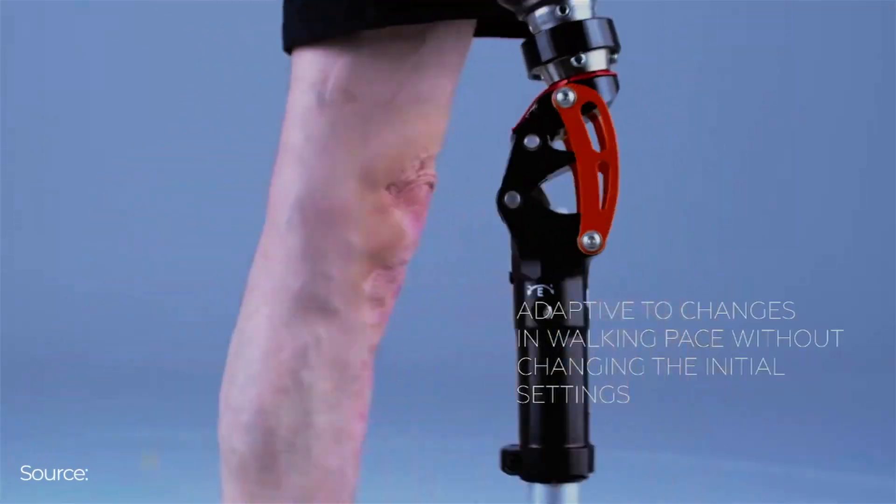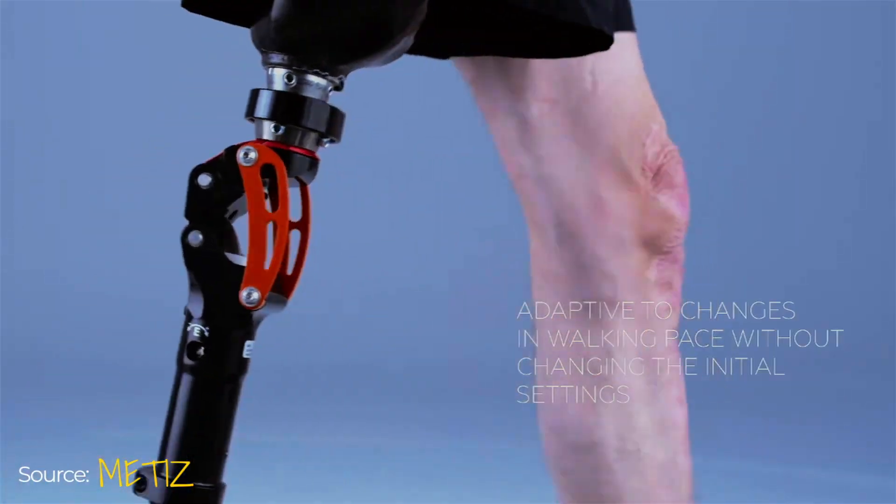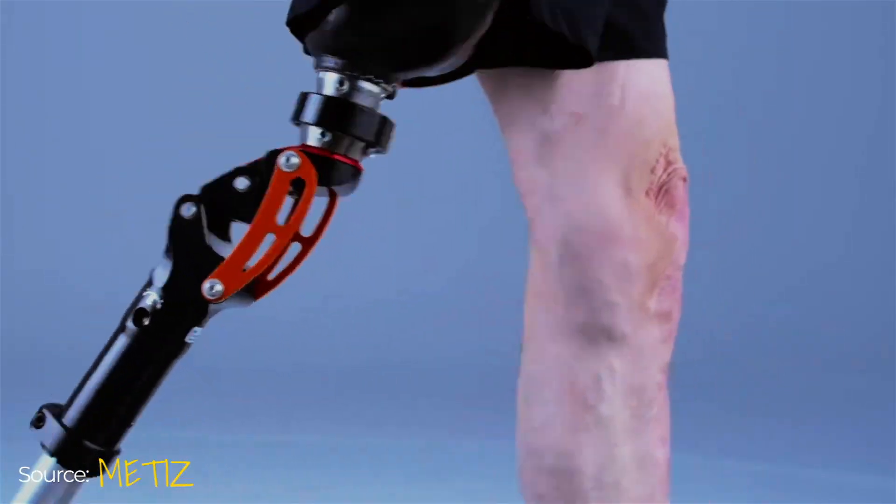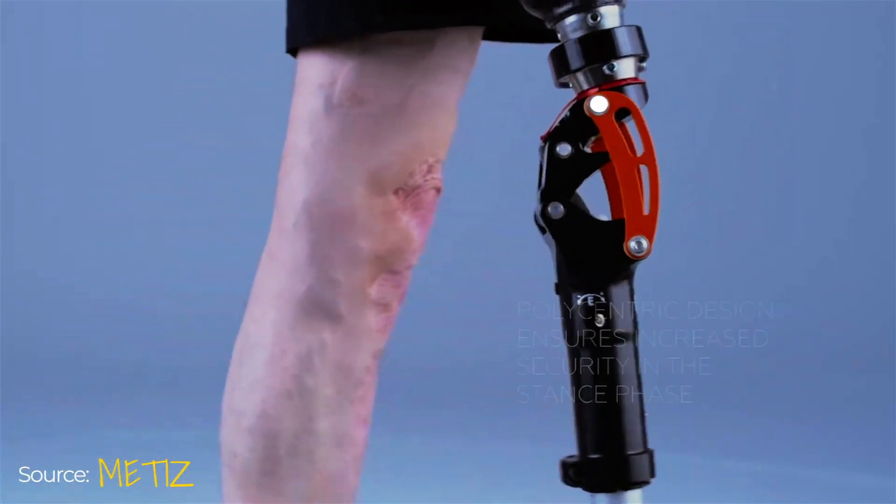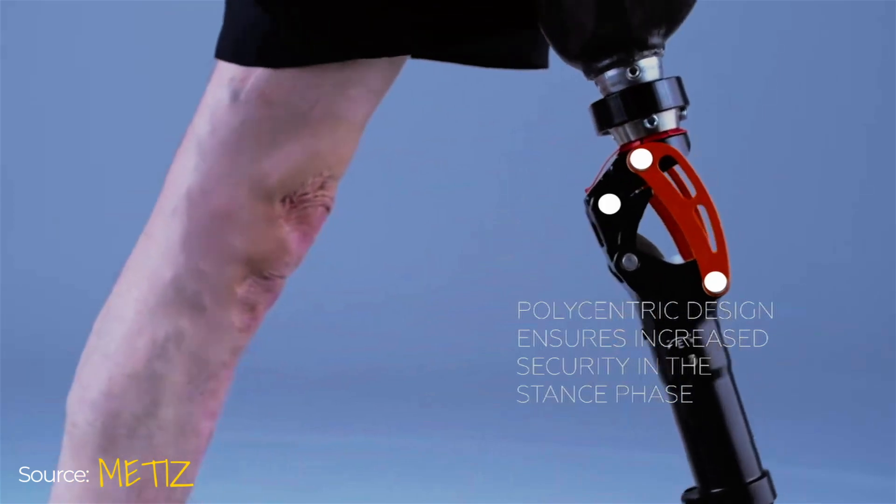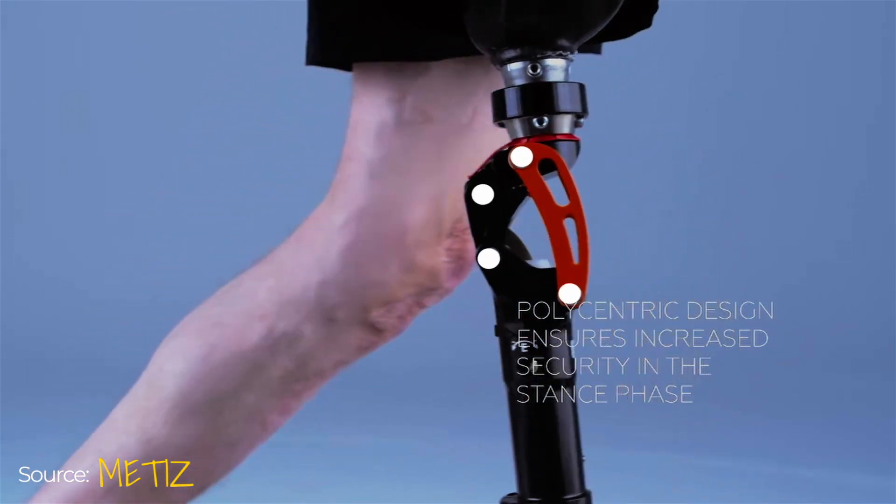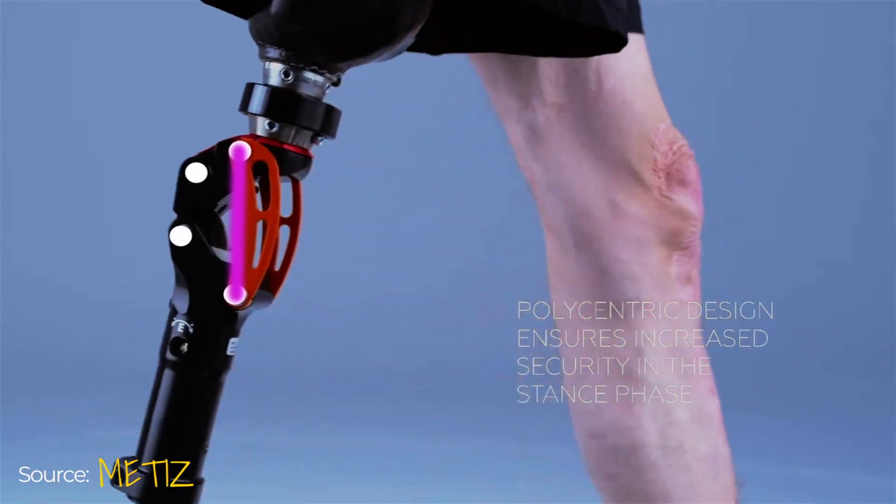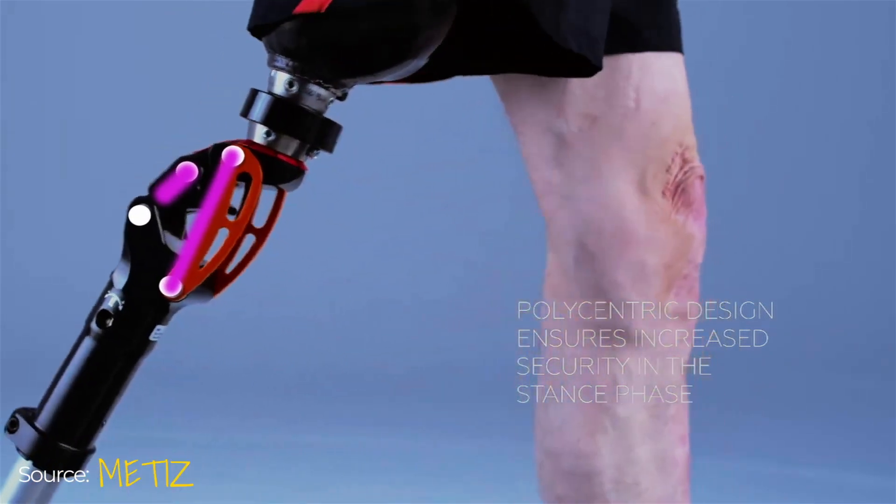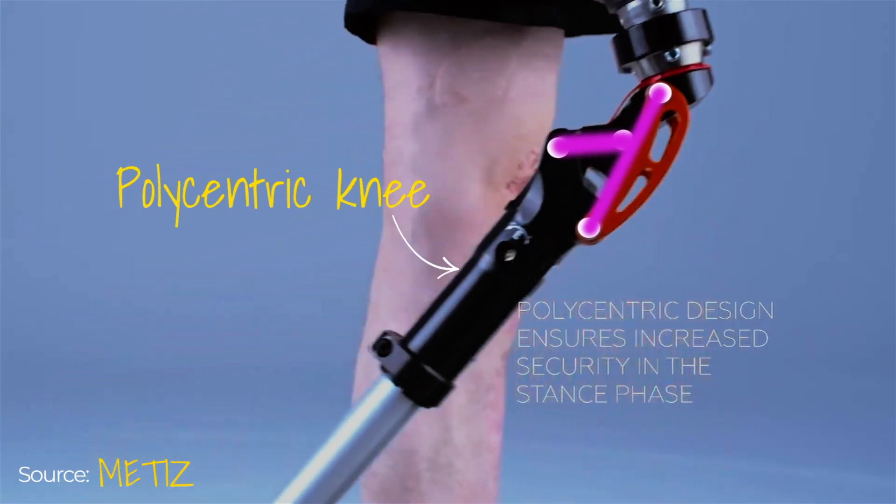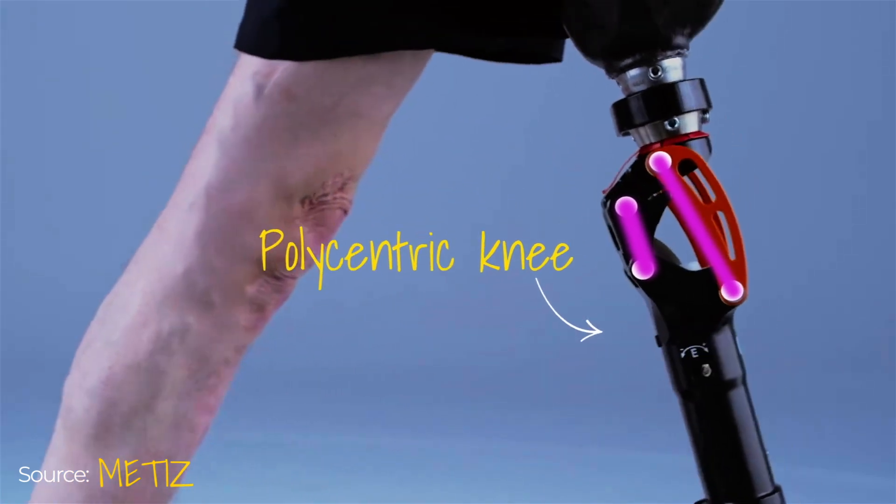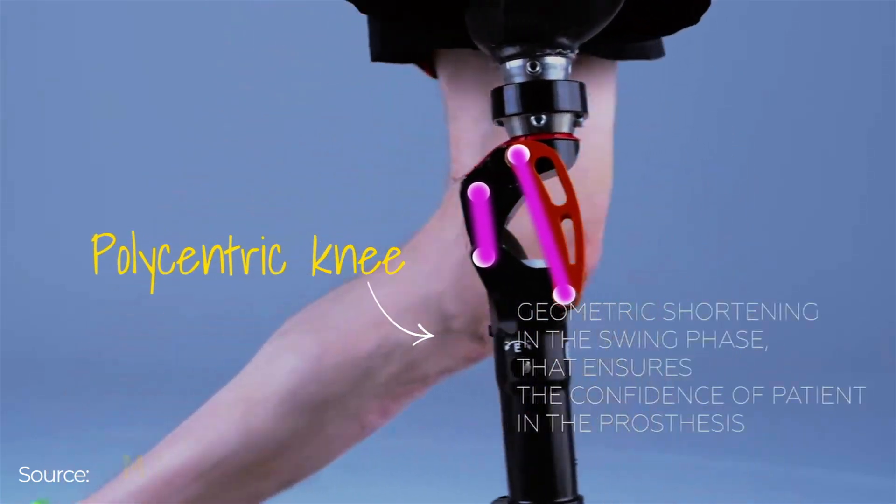This prosthetic knee doesn't just bend, it shortens the leg mid-step and projects its pivot point to another location to help the amputee walk better. Sounds insane, right? Let me tell you, it's real and not so complicated as you might think, but damn clever.